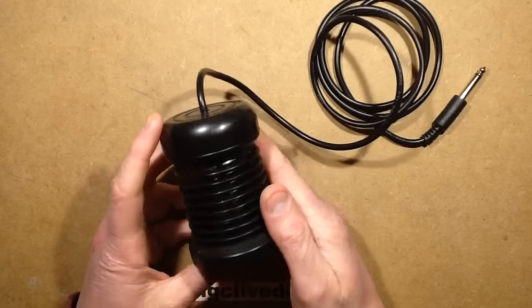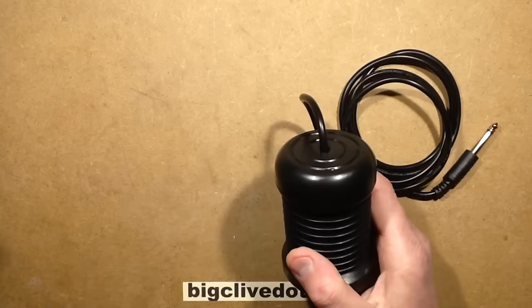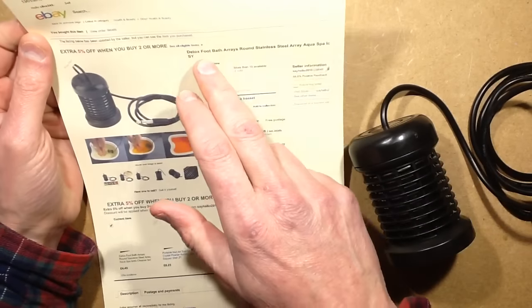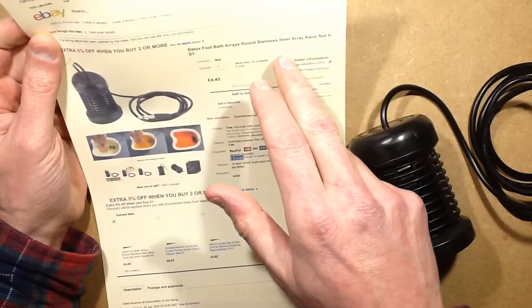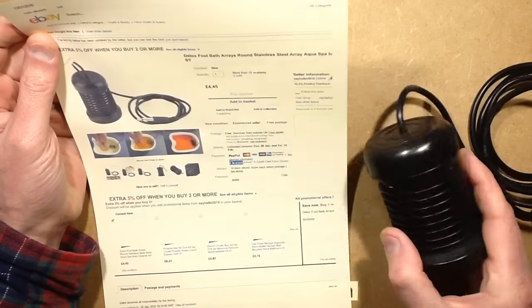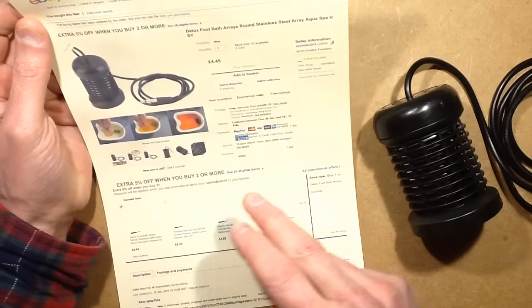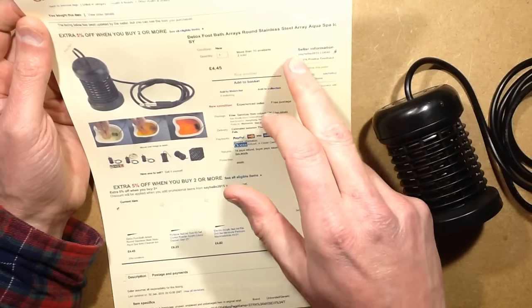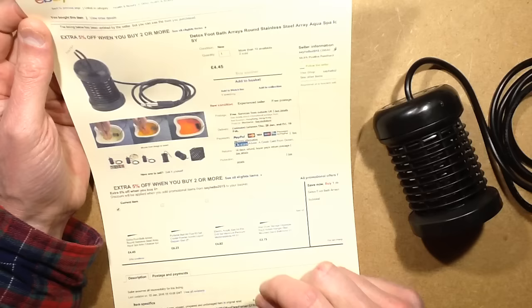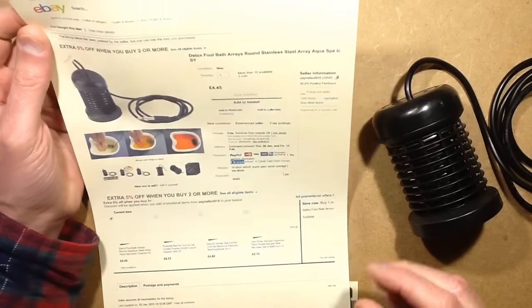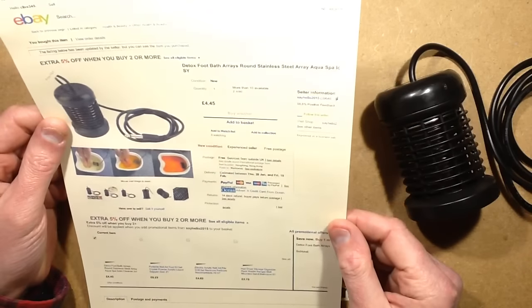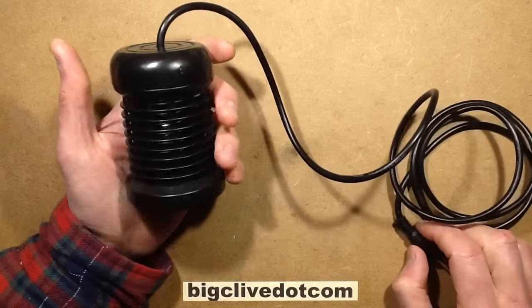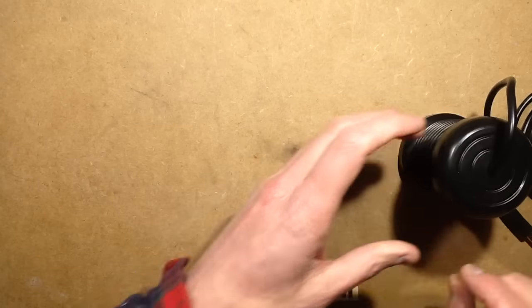So this electrode here, this is one of the consumable electrodes, came from eBay, surprise surprise, from China, bigger surprise. It's described as a detox foot bath array, round stainless steel array. Stainless steel, really? And it cost £4.45, and it came from a seller called Say Hello 2015, which is one of the easiest names to remember in a while. Yes, it came from eBay, and the idea of these things is that you, well, I'll do a wee doodle actually.